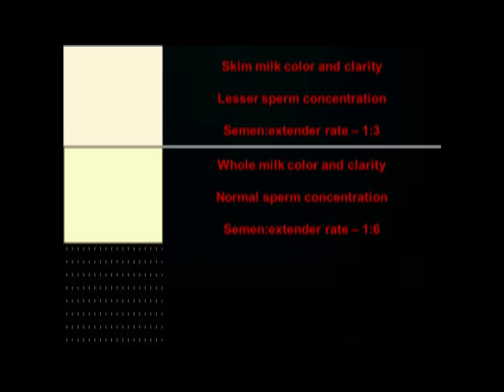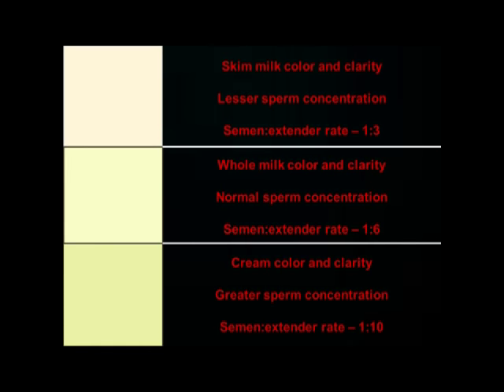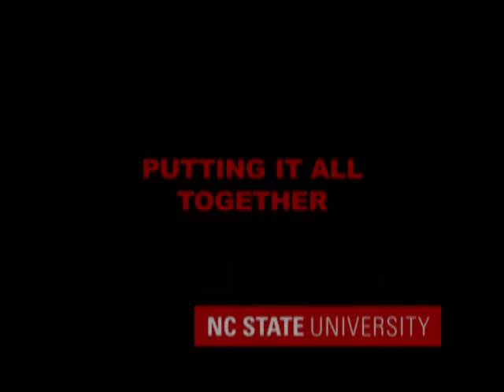Similarly, semen that is less clear and with a color and consistency of cream will have the greatest total sperm numbers, and we can extend this semen farther and into more individual doses by using a semen to extender rate of 1 to 10. Producers should be aware, however, that these figures serve as good ballpark estimates, but because of large inherent variation in individual boars, producers may find in time a need to adjust their dilution rates to best meet their own personal reproductive needs.